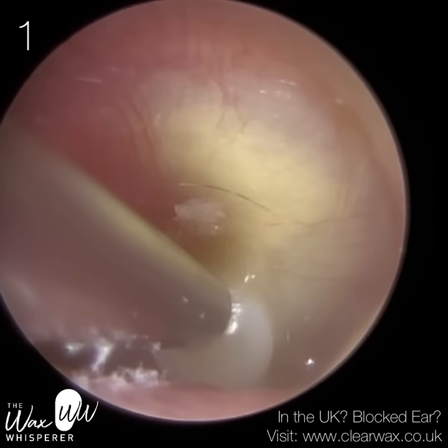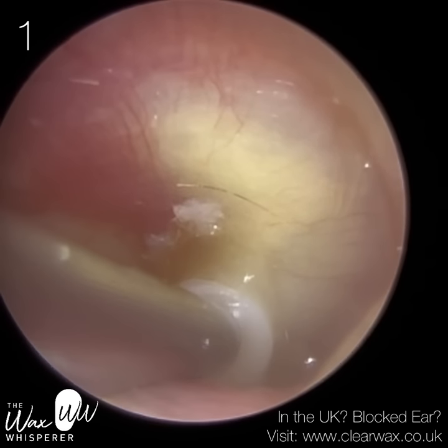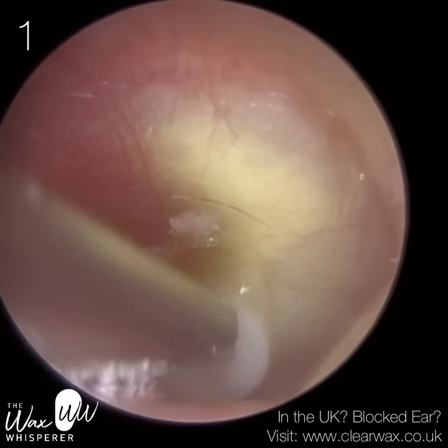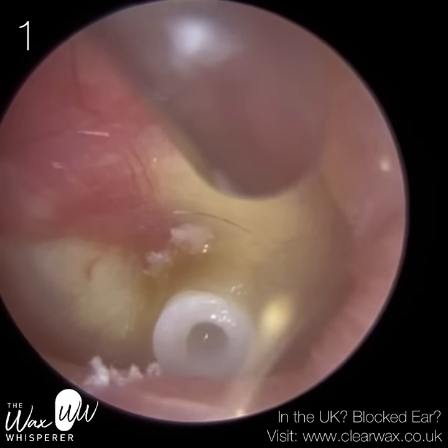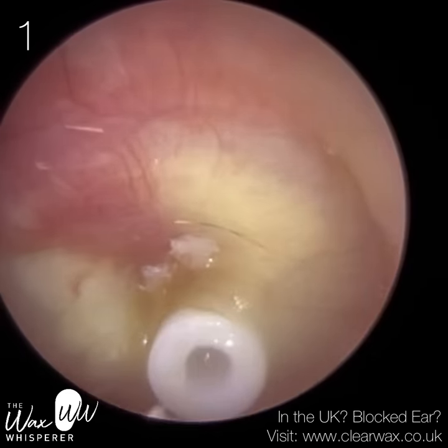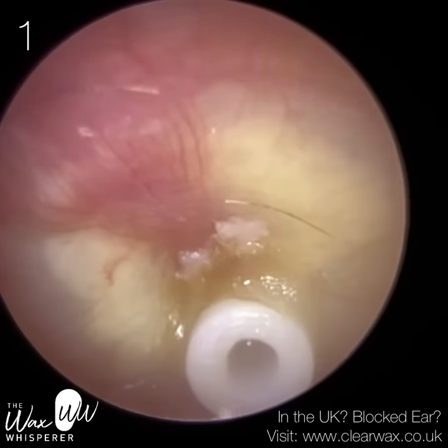There is a puddle of purulent discharge — otitis media with effusion, it's got many different names. This discharge is originating from behind the eardrum in the middle ear, as opposed to the ear canal itself. If this discharge was originating in the ear canal itself, we would call that otitis externa — an outer ear infection. And that white object there is a grommet.